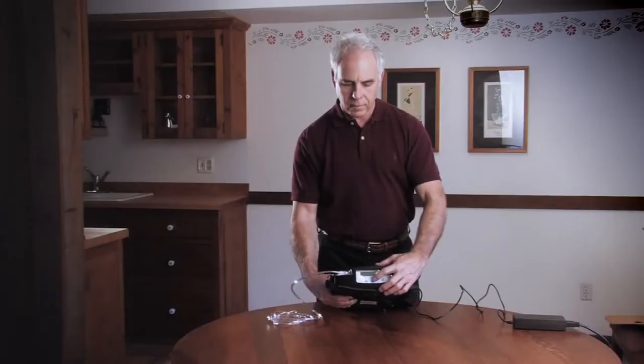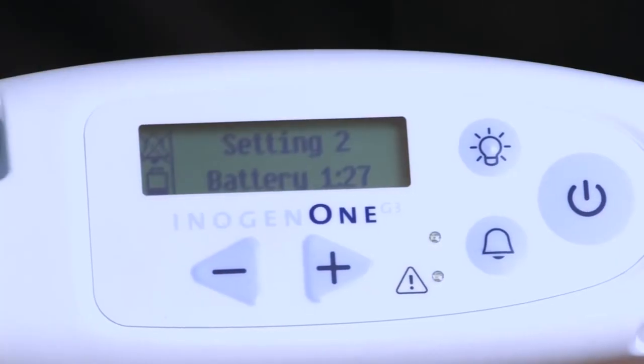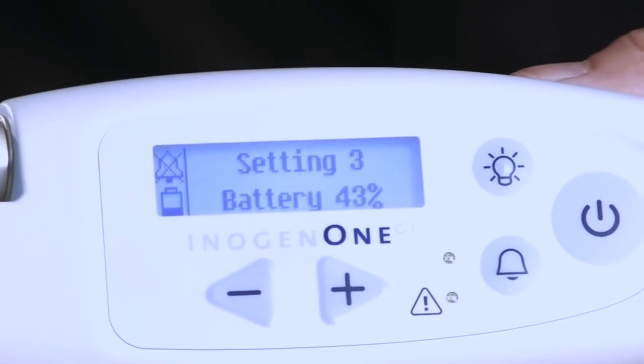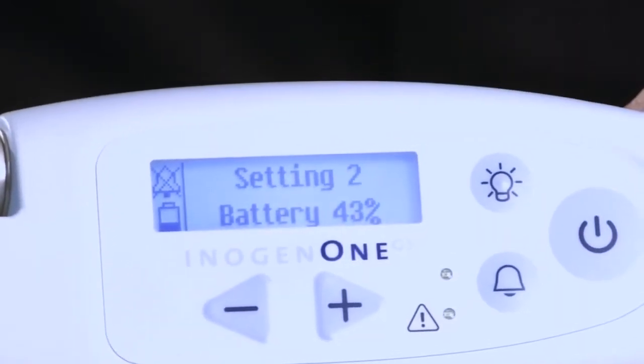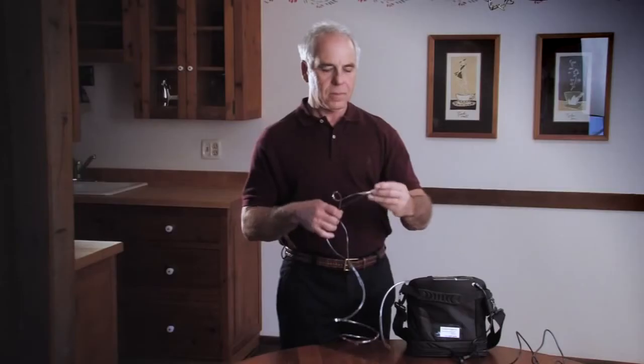Set the flow settings to the flow rate prescribed by your clinical professional. The flow setting can be changed by pressing the triangular flow setting buttons that are marked with plus and minus symbols. Now position the nasal cannula on your face and breathe normally through your nose.